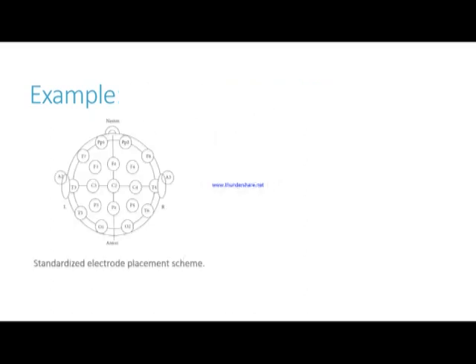For motor imagery, band power features are usually extracted in the alpha frequency band, which is about 8 to 12 Hz, and the beta frequency band, which is about 16 to 24 or 30 Hz. It depends on the application. For electrodes localized over the motor cortex areas of the brain around locations C3 and C4 for right and left hand movements respectively.